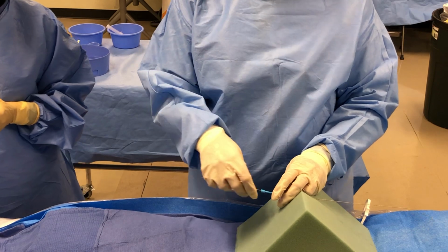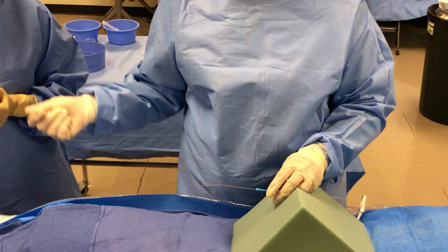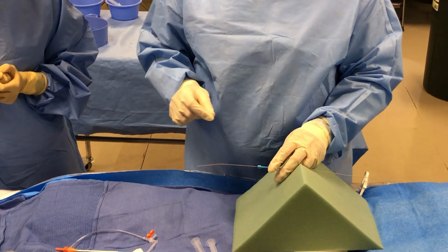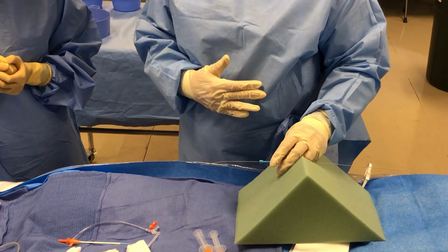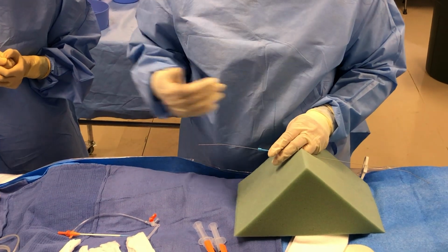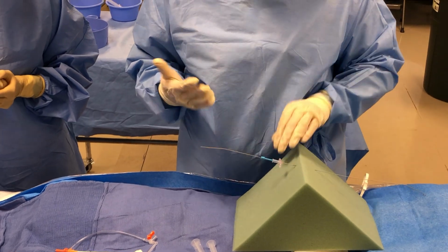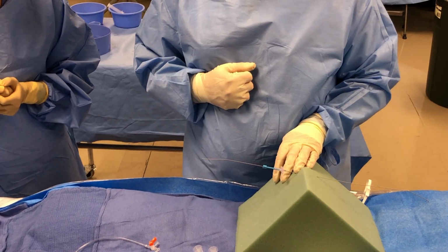As long as it goes smooth, we're good. If they feel any resistance, they're going to pull it back out, maybe readjust. We don't want to go through the vessel or into the intimal lining. They're going to feel resistance if that wire is trying to do that, okay? Everything's going smooth, then they're going to stop at that point.